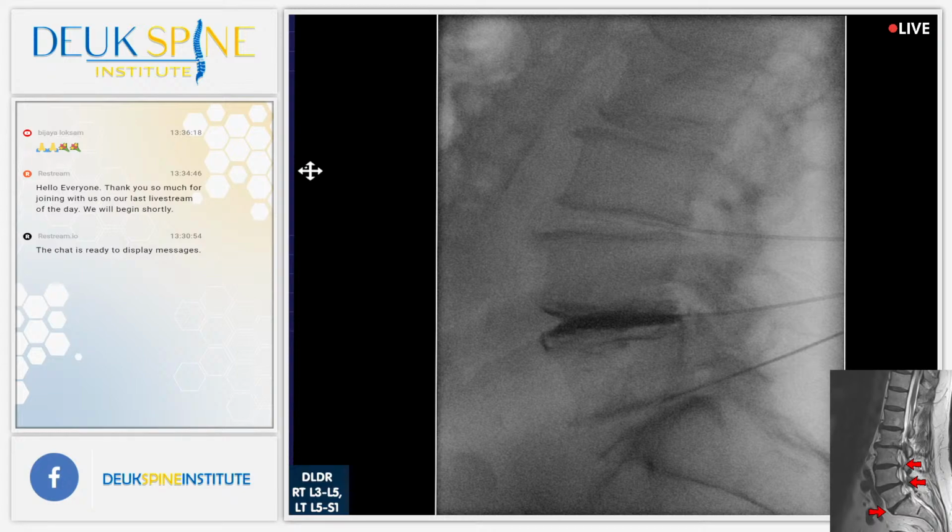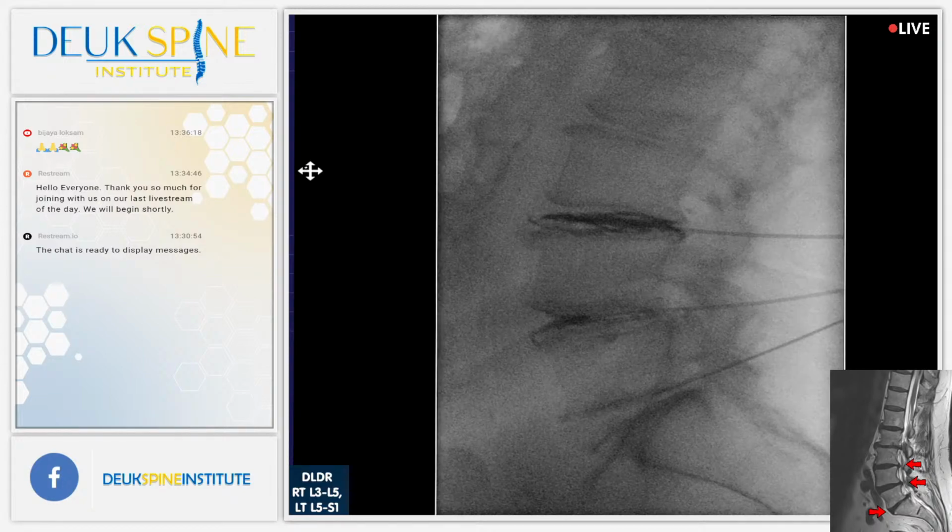All right. How bad is that on a scale of 1 to 10? 10? 9.5. 10. We just do 10. All right. So I can't test the third one, but the two that I tested are 10 out of 10, and they're your typical pain. You get to go to sleep. When you wake up, we'll be done.